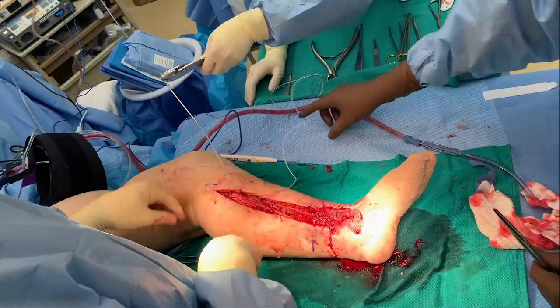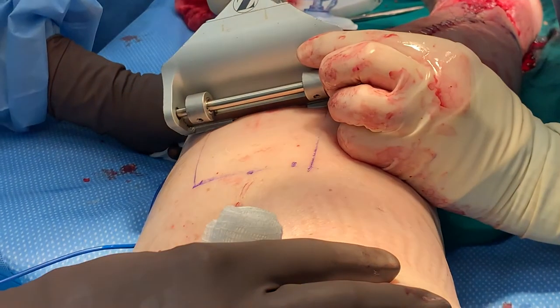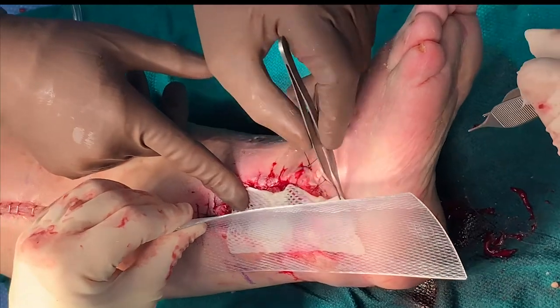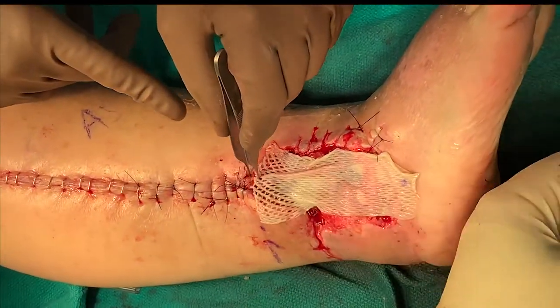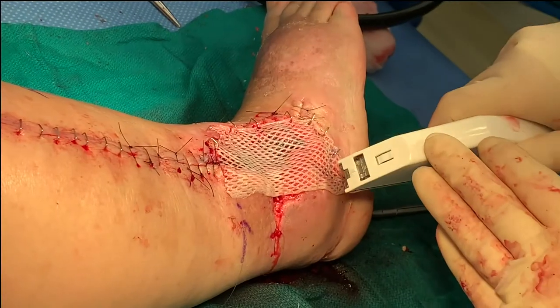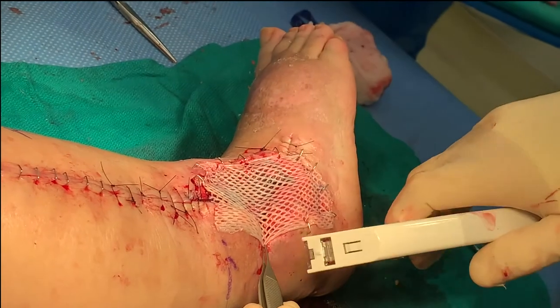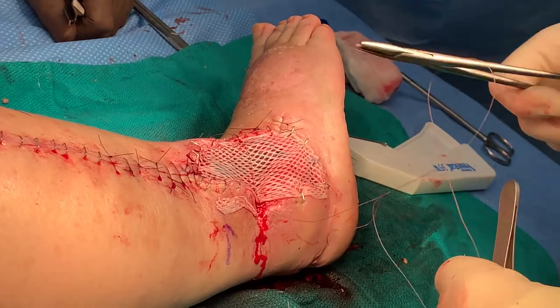We place a small drain in the donor site cavity and close the donor site in layers. We then harvest a split thickness skin graft from the ipsilateral thigh at 12 thousandths of an inch thickness and then mesh it at a ratio of 1 to 1.5. We soak a sponge in 0.25% bupivacaine and epinephrine and cover the donor site. The split thickness skin graft is then attached along its periphery with surgical clips, avoiding staples directly on the muscle flap where possible. We use a 4-0 chromic or monofilament resorbable suture to attach the skin graft if crevices or small depressions exist in the interior of the graft.